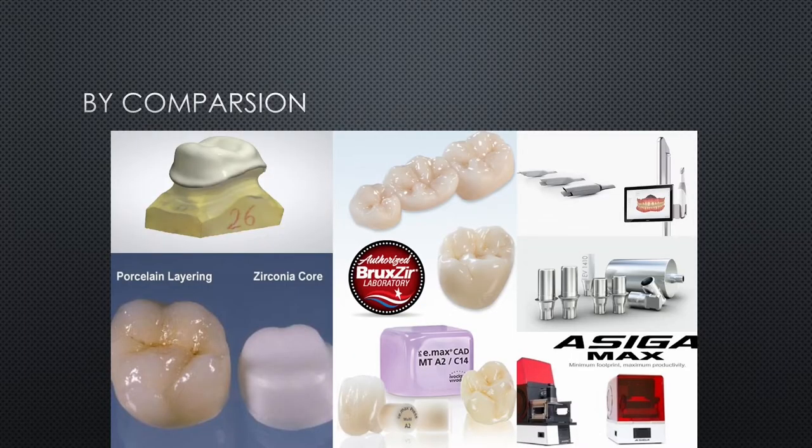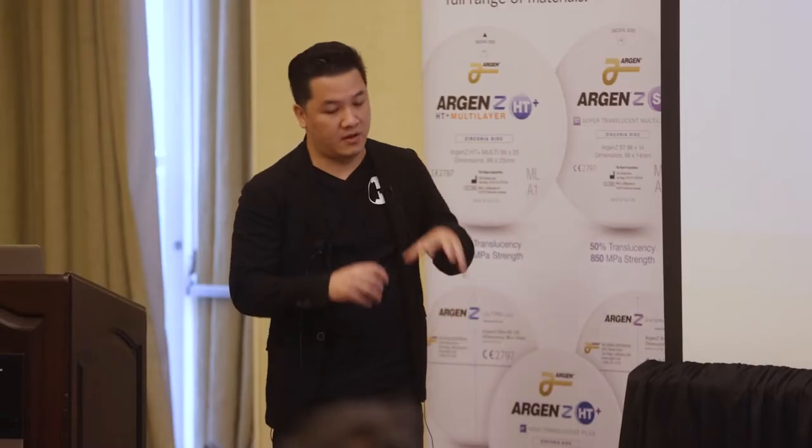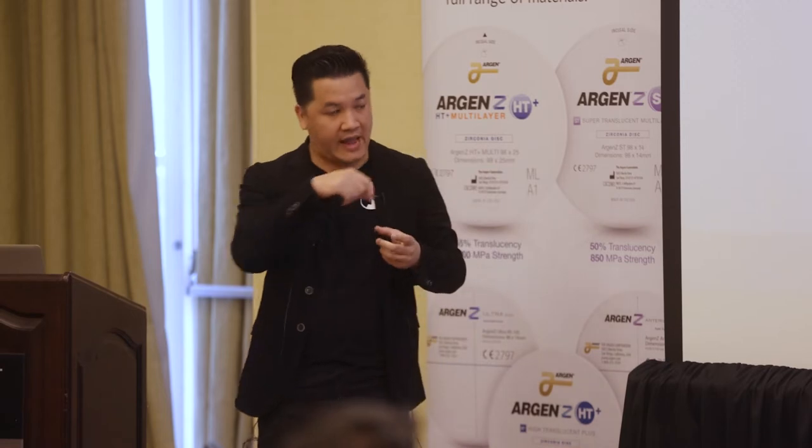I did my first copings about 2-3 months in, on these ugly little zirconia copings in 3Shape, where you only had the die and you had remove. We'd cover them with porcelain just like we would with the PFM.